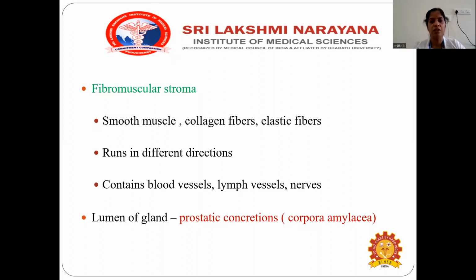That is nothing but the prostatic concretions. These glands produce some secretions. In elderly males, these secretions condense and form hard parts named prostatic concretions, also named corpora amylaceae.